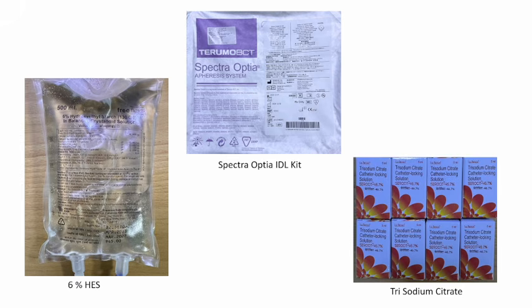So here in the picture, we have the various requirements for the procedure. We have the 6% HES solution, which we are using as the sedimenting agent. We also have the Spectra Optia IDL kit, which is used for granulocyte collection. And we also have the trisodium citrate, which is being used as an anticoagulant.